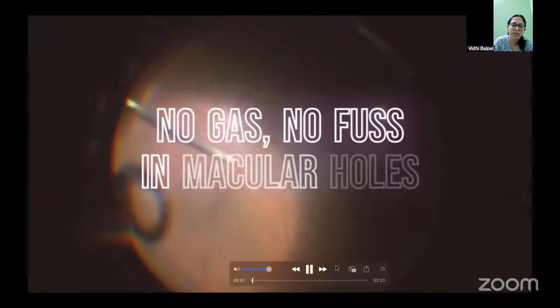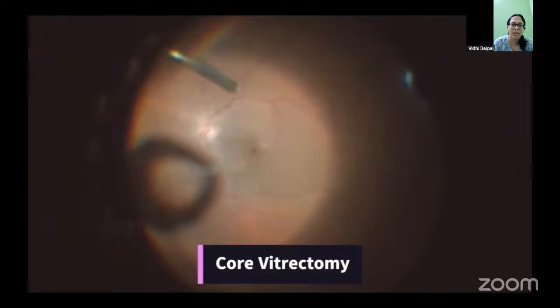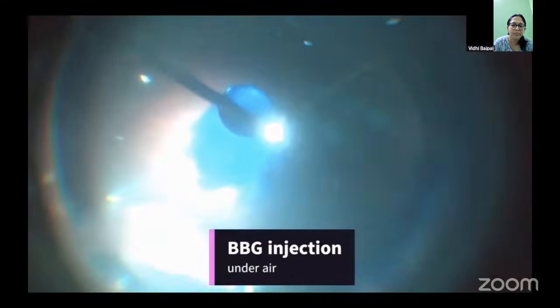Thank you, Dr. Bhatik. Thank you for this opportunity. So this is a technique which I've been practicing for the last 1 year now. Began in the last 6 months of my fellowship and then has continued on as my consultancy as well. So the normal basic steps where you do core vitrectomy and then we induce PVD and complete the vitrectomy.